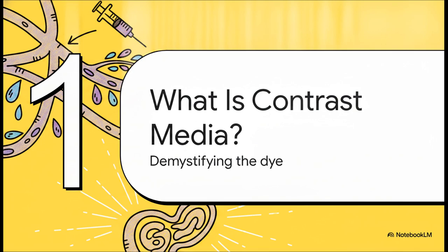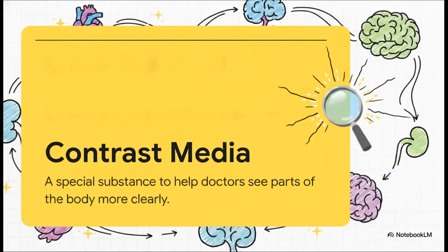Section 1. What is contrast media? Demystifying the dye. So, when you hear the term contrast media, which, by the way, is often just called contrast dye by patients and medical staff alike, it refers to a special substance designed to help doctors see certain parts of your body way more clearly during imaging tests. Now, to be clear, it's not a treatment, and it doesn't cure anything on its own. Instead, think of it almost like a high-tech highlighter for your insides. It reveals all those tiny details that would otherwise just remain hidden in the shadows.